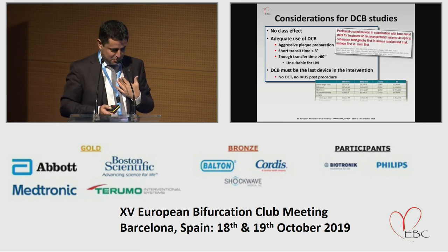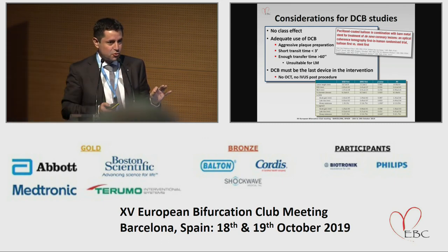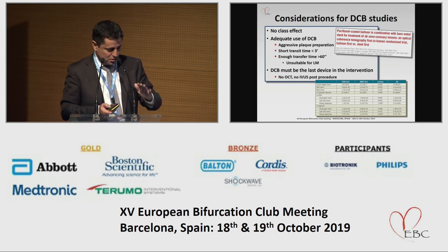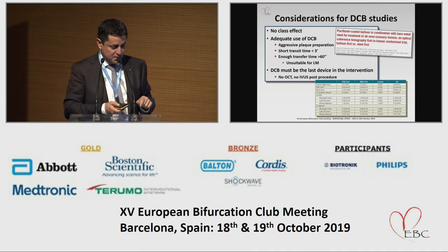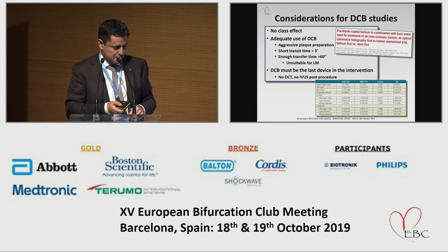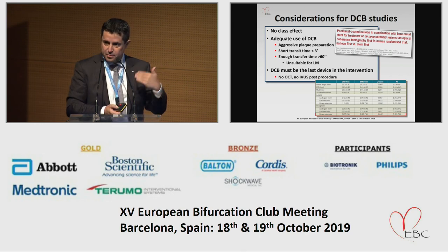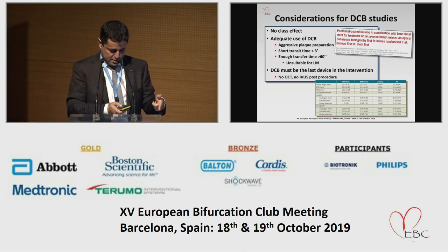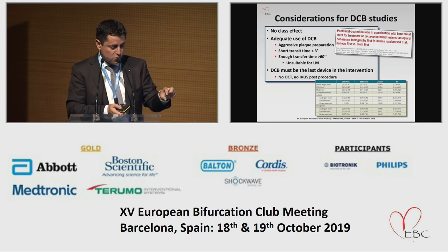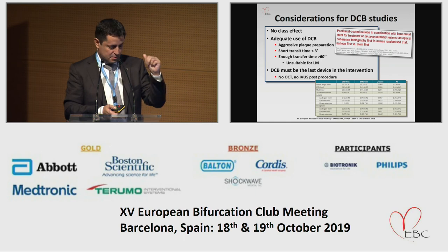Something which is my perception, and is against the German consensus, is that maybe the drug-coated balloon should be the last device in a coronary vessel if we are going to use it to treat whatever. One example is this study that we published using OCT. If we look, the binary restenosis was much higher than in the previous PEPCAD studies. And it was even higher in the group that used the drug-coated balloon first, a combination of drug-coated balloon plus bare metal stent.